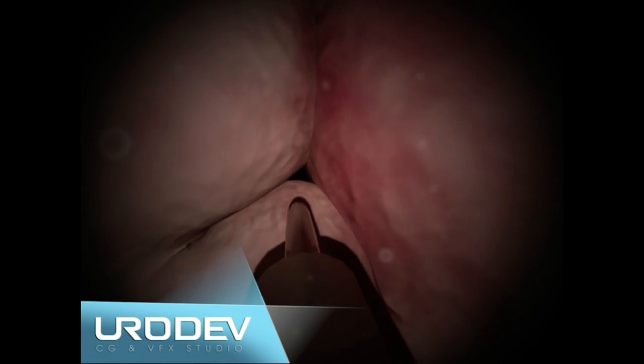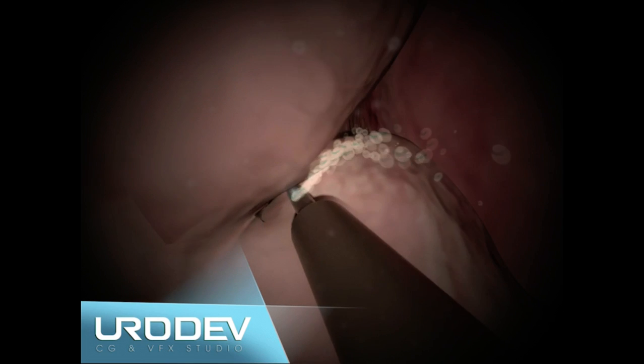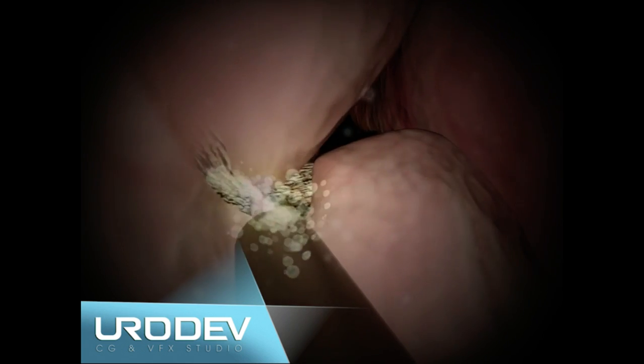A cystoscope is introduced through the urethra with a laser fiber. The high energy of this laser allows coagulation of the blood vessels, avoiding hemorrhaging.